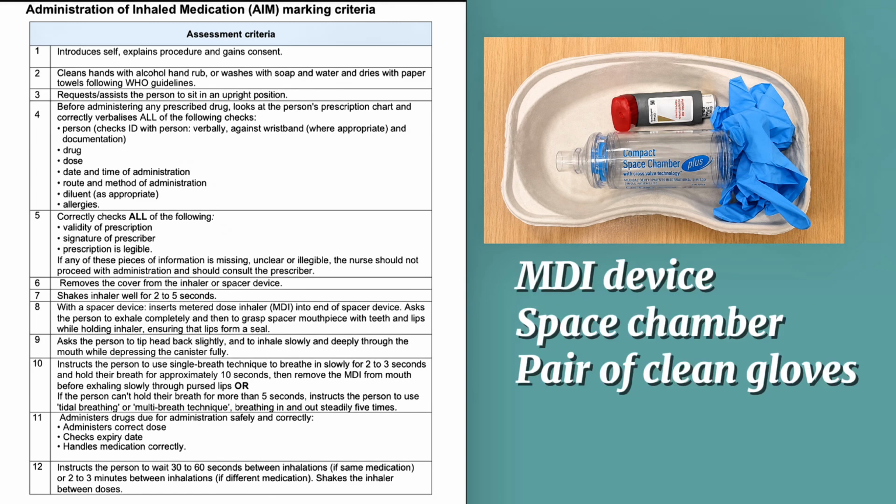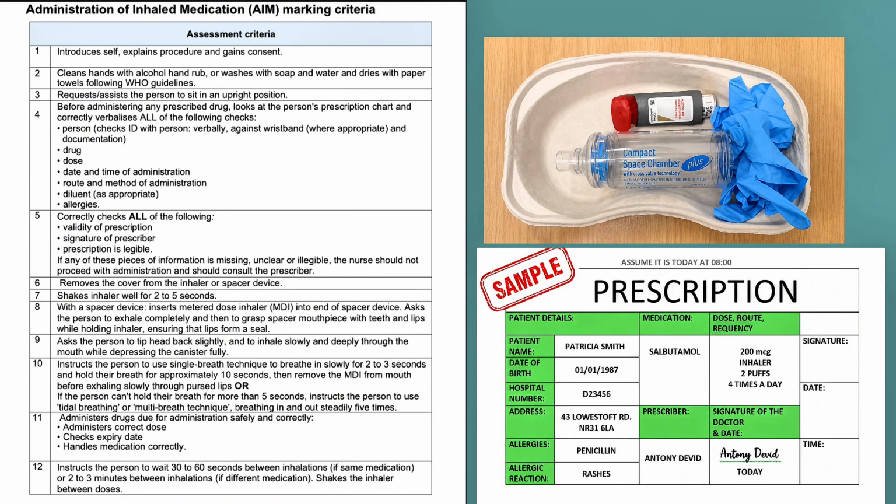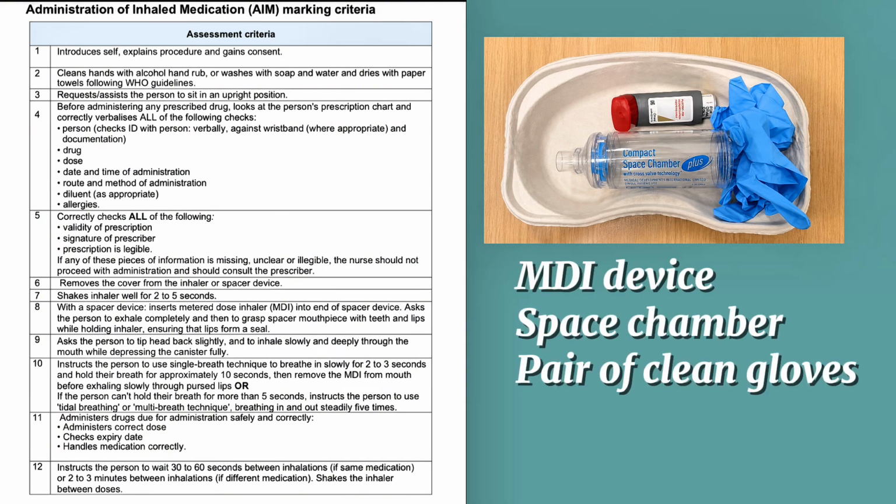Miss Examiner, we are going to use a disposable tray, metered dose inhaler, MDI device. Check against the prescription sheet. Medication name is salbutamol. Dose, frequency and route is 200 microgram, 2 puffs, 4 times a day, and inhaler. The expiration date is 23rd of June 2030.